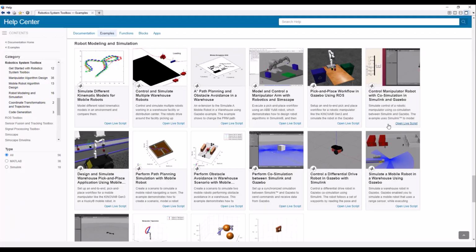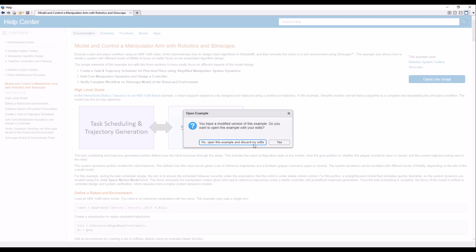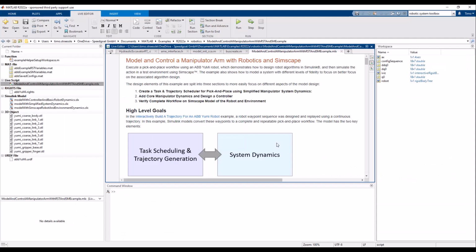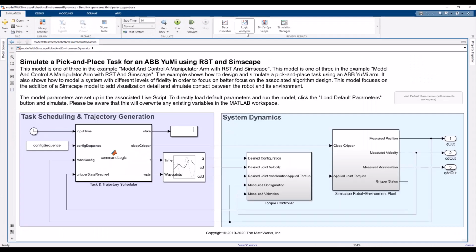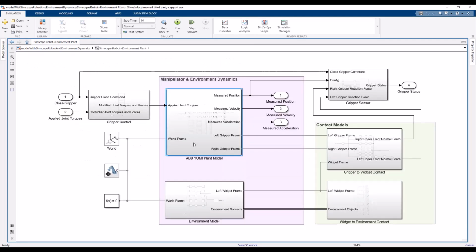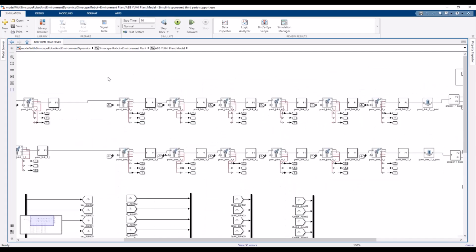To get a head start in adding the controls, we can refer to one of the many examples shipped with the Robotics Systems Toolbox. For our use case, the example Model and Control a Manipulator Arm with Robotics and Simscape seems perfectly suited for the task. When we open the model, we can find a similar Simscape implementation of a different robot arm, which we could replace with the one generated from our CAD model.